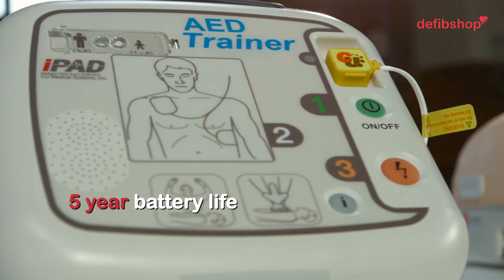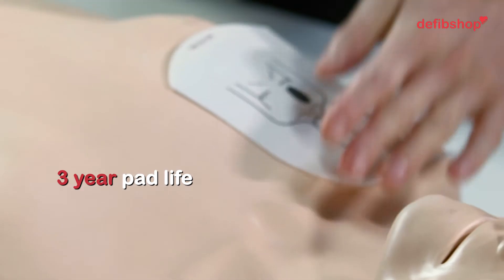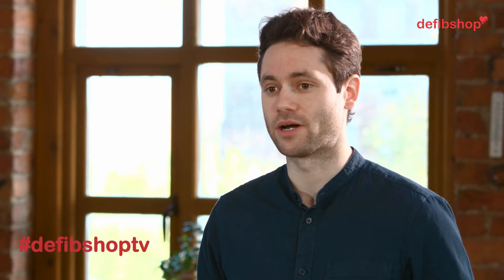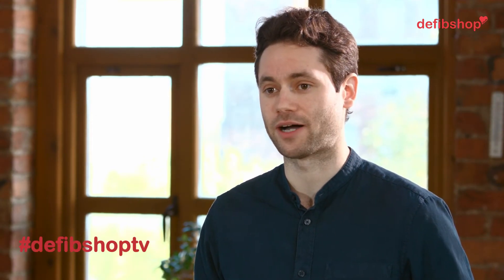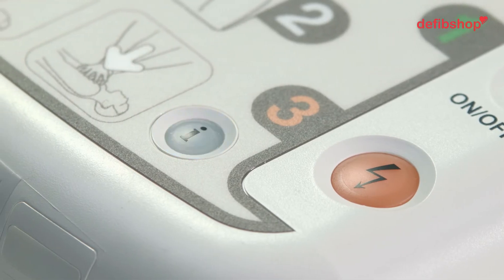It has a battery life of 5 years and the life of the electrode pads is 3 years. After this time, they'll need to be replaced. But don't worry, because Defib Shop will send you a reminder email before they expire. As with all pads, they can only be used once, which is why we recommend that you purchase a spare set with your defib.